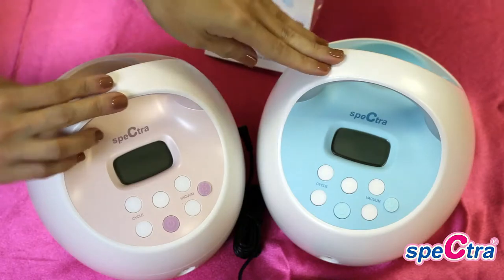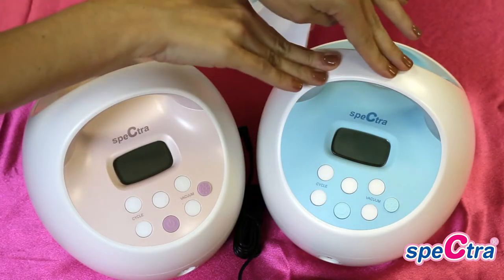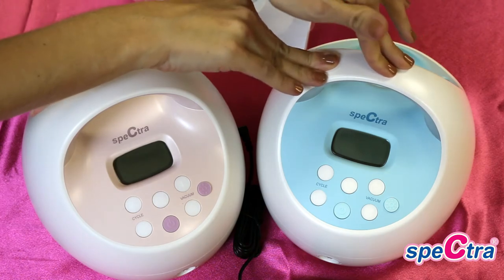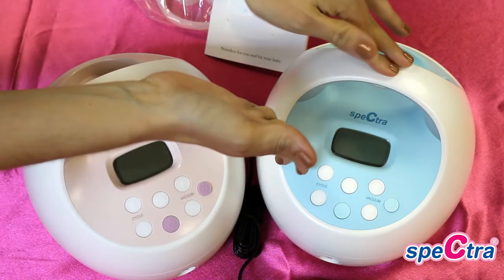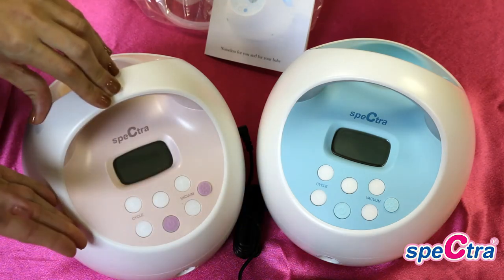The S1 pump will have the same setup and function as the S2 pump. The only difference is it will also have a built-in rechargeable battery and be blue in color, versus the S2 pump which is wall plug-in only and has a pink color.